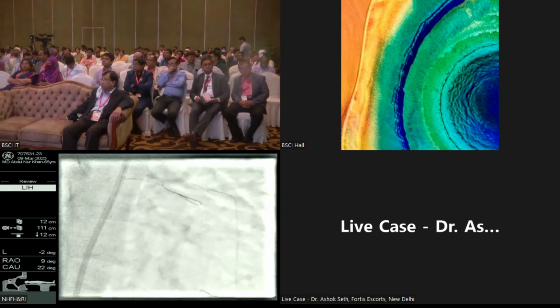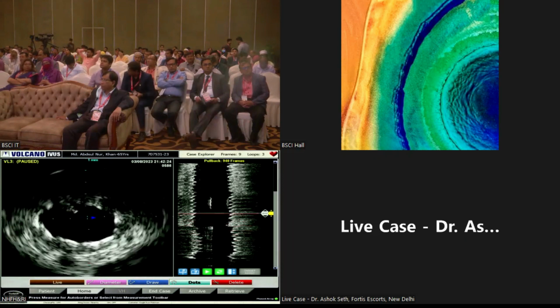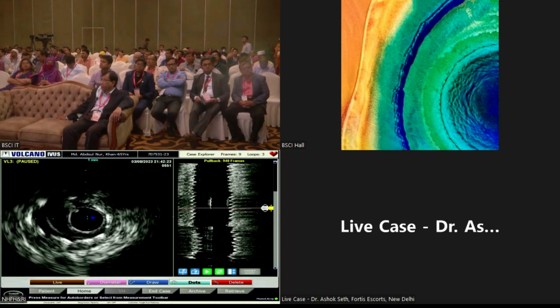What was your initial diameter of the left main, madam? Vessel diameter? That was 4 millimeter. And we have post dilated with 4.5. Enough.